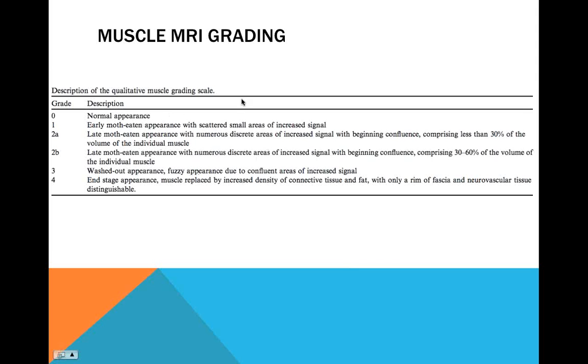So one, I think it needs to be consistently described in a muscle grading scale, and two, we have a person who has his own scale at Johns Hopkins who's collaborating with us to describe this even further according to his scale, so we're going to try to see which one is a bit more sensitive. And in theory, even though this is kind of a subjective measurement, it is given a number and we could potentially follow that over time and also see what muscles are more involved than others and come up with one of these schematics as well, which I think is really useful in terms of trying to figure out these patterns when you look at these muscle MRIs.